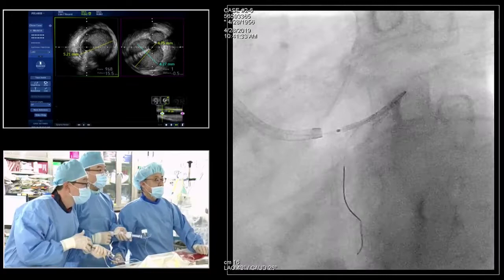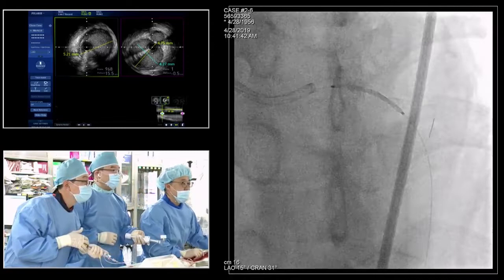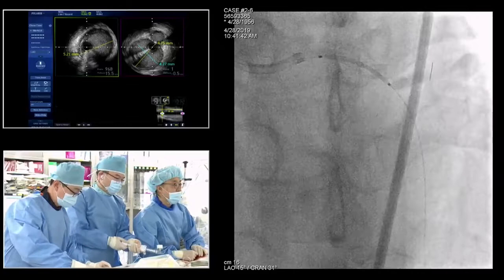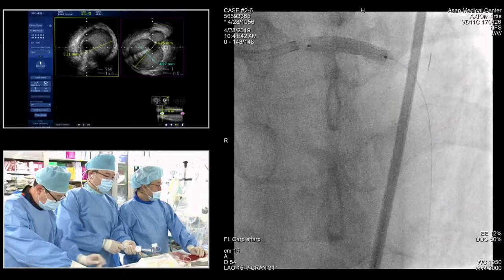Okay, tester. Shallow area. This is good to see the ostium of the main, tester. Okay, go. 11, nominal. 12. Save. Deflate. Okay.